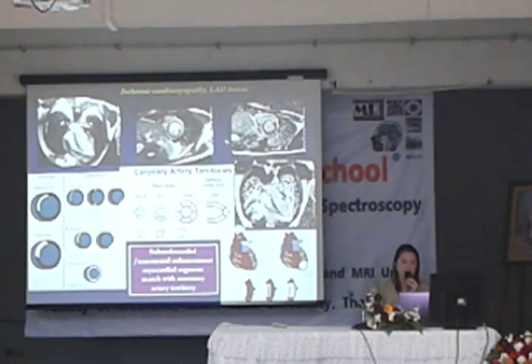And we use the myocardial delayed enhancement pattern to differentiate ischemic from non-ischemic causes. The ischemic cause should show enhancement like this, which is enhancement at the subendocardium, or the inner wall of the left ventricle, or transmural enhancement, which should match the vascular territory.